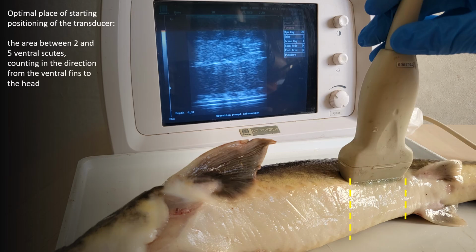There is no sense to place the transducer closer to the pelvic fins, because in this case we can see only the end of the gonad on the screen. Further, from this position, the transducer is moved towards the head, slightly changing the tilt angle, trying to avoid sharp movements.